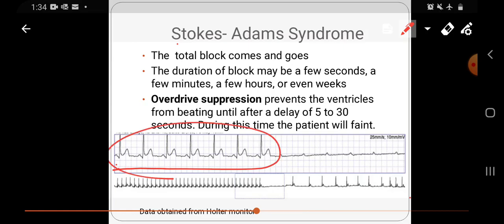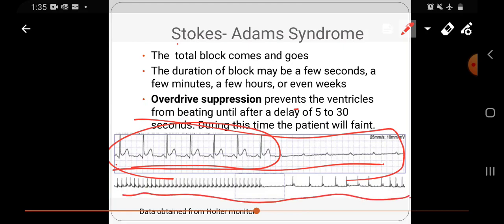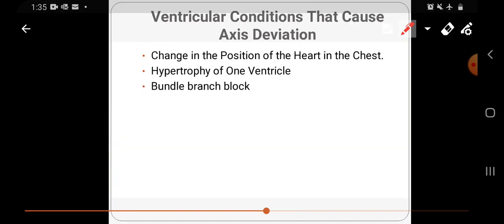عشان هيك هدول المرضى بنعمل لهم نوع من ال ECG اللي هو بيكون portable، يعني ال patient will take this device home، رح تعمل له ECG لمدة 24 أو 48 hours. بعدين بس يرجع على العيادة بتطلعوا الداتا من الجهاز هذا اللي اسمه الهولتر مونيتور، بيكون عامل ECG على مدى 24 أو 48 ساعة. ممكن خلال هاي الفترة إذا صار عند المريض الإبيسود إنه يبين عنا على ال ECG strip like this, okay. فهذا هو الستوكس آدمز، فهو عبارة عن variety من الثيرد degree.